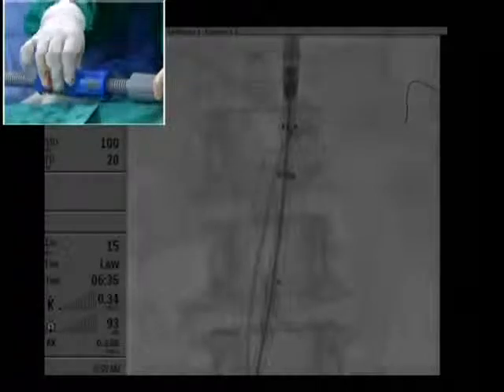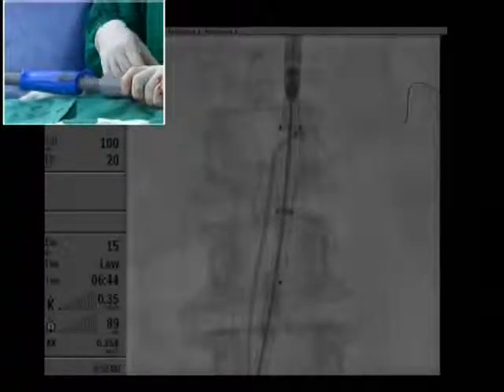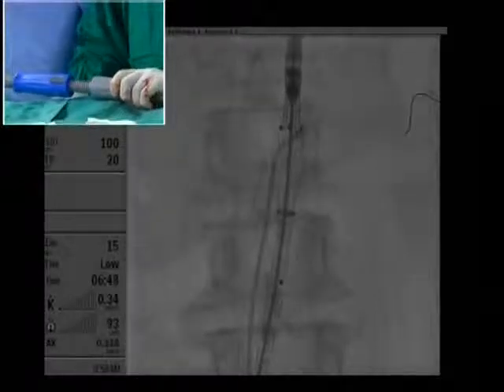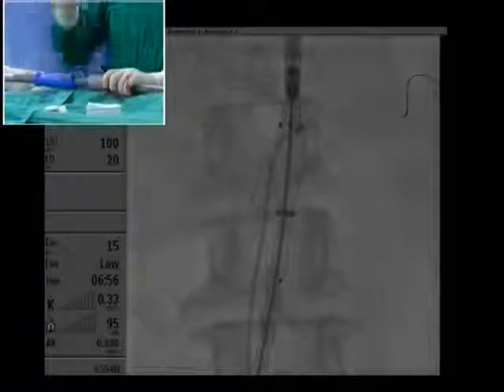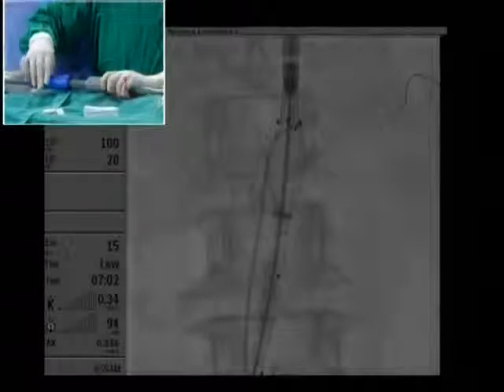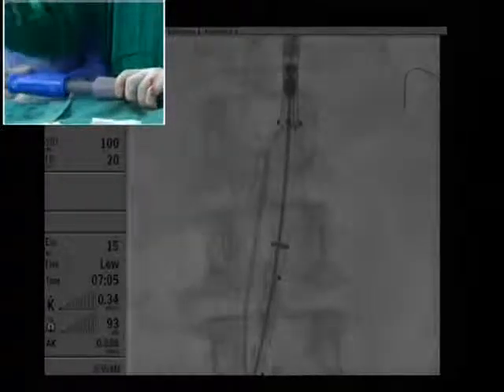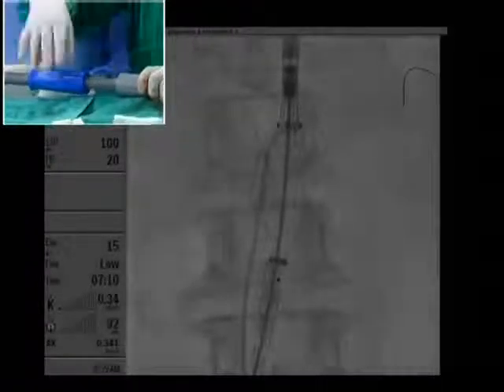There it goes. So now the first stent is opening out. Test again, please. It's probably okay. Let's check the contralateral gate. Show lower down. Okay, go back up. You can see an E at the top of the device, which is what you should be seeing when you want the contralateral gate to open on the left side. If you want it to open on the right side, then it should look like a 9.